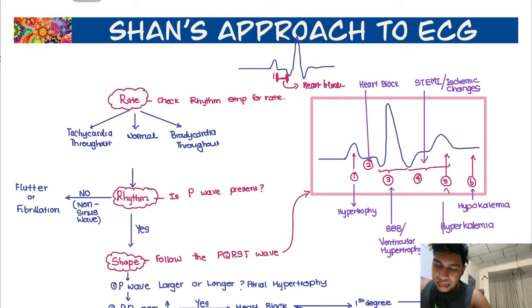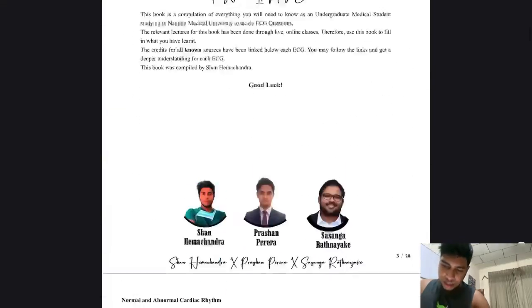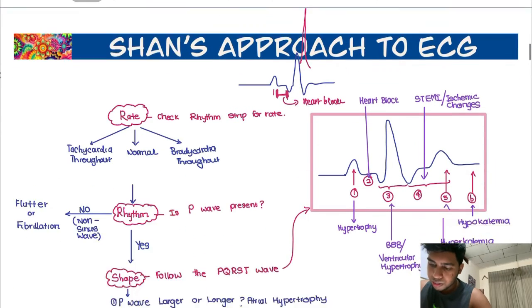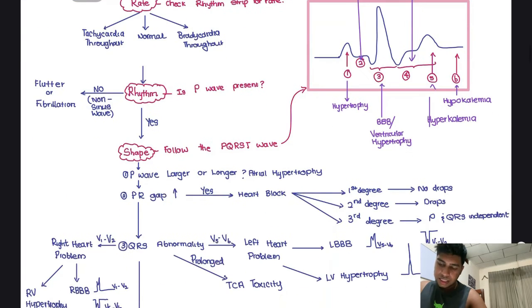Okay? And you look at the T wave, and if you find it has elevated together with this, it is a condition in which, sorry, I forgot the condition, let me check. Hyperkalemia, a rare condition. You will not be asked those questions in the fourth year. And if you find a U wave, that could be a hypokalemia situation. This is all you need to know for ECG.